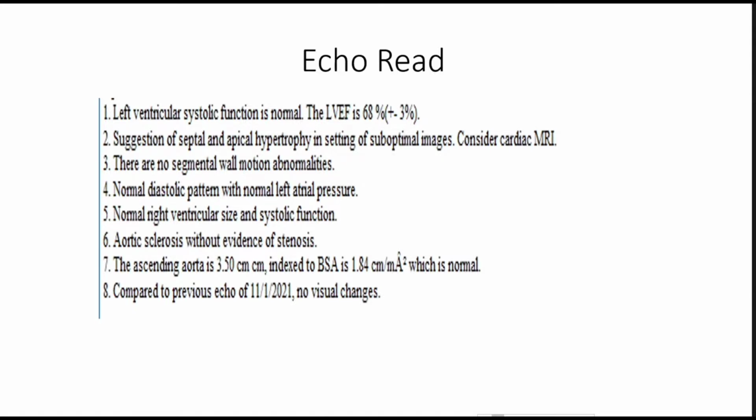And the EKG can be a very nice tool for the sonographers, particularly, let's just say you're not getting great images, you think the images are foreshortened, and you want to get a better sense. Maybe for whatever reason you can't give contrast. The EKG could be a very nice clue. And in particular, that V4, V5, V6 really localizes to the apex.